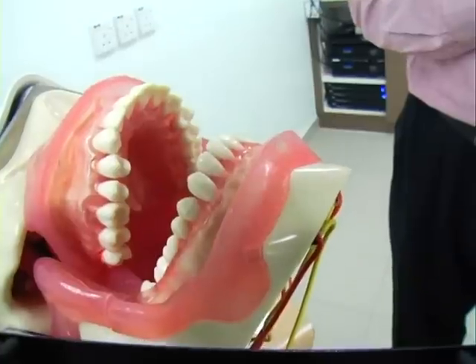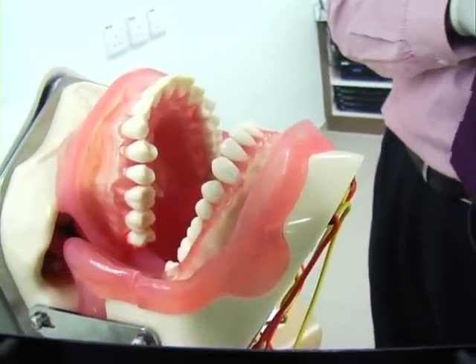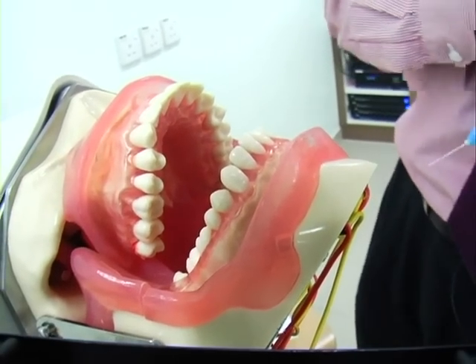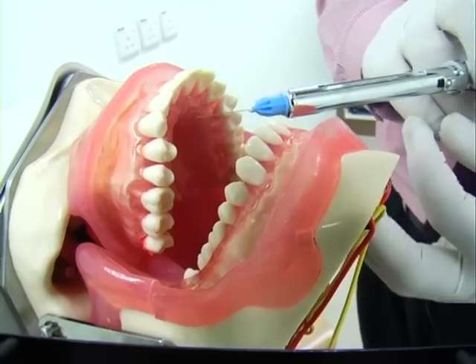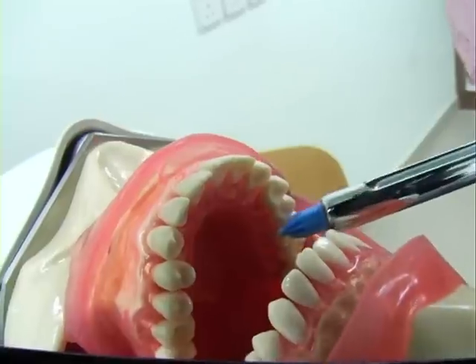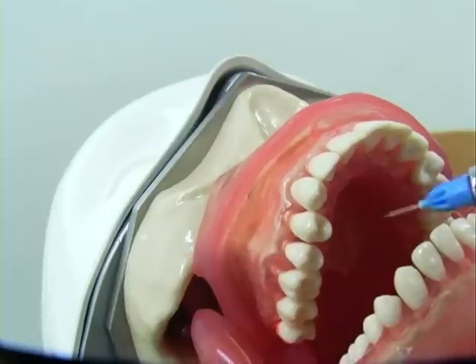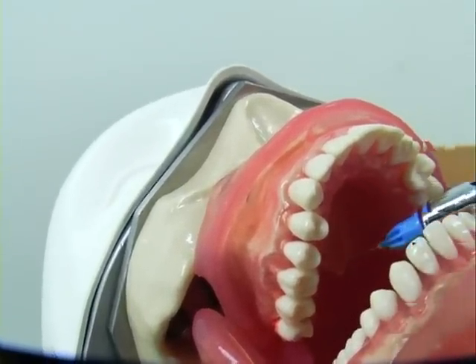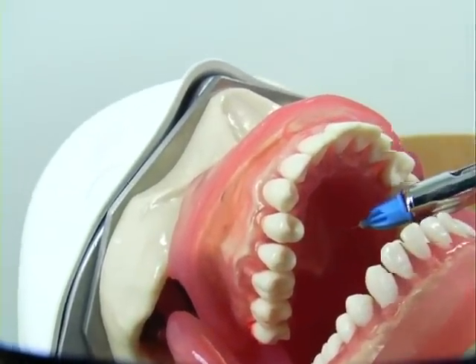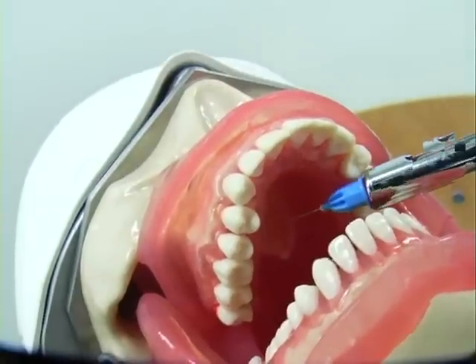We are now going to demonstrate how to administer infiltration anesthesia around the maxilla of a mannequin. For infiltration on the palatal side, you have to draw an imaginary line on the patient's mid-palatal area, and another imaginary line dividing the midline and the gingival crevice.